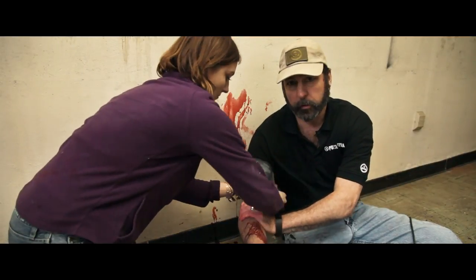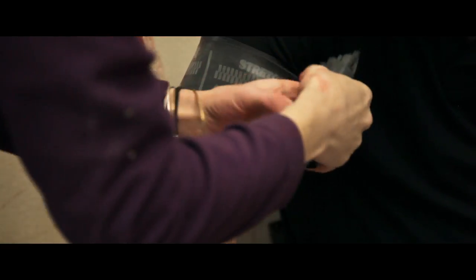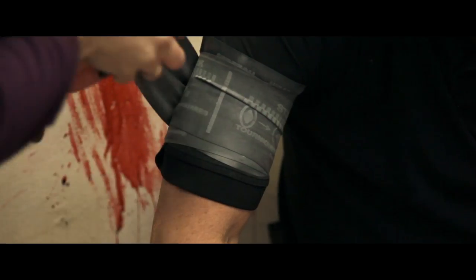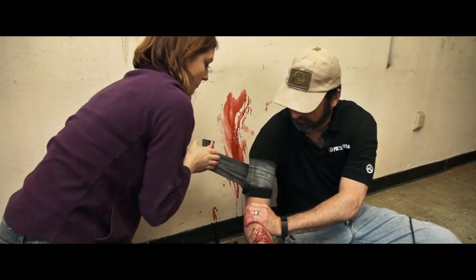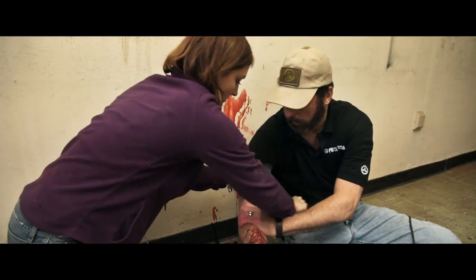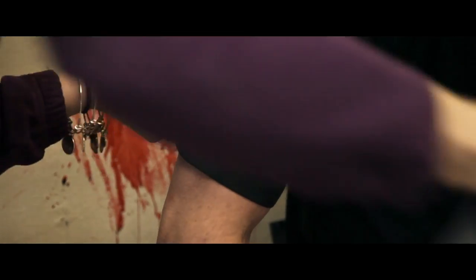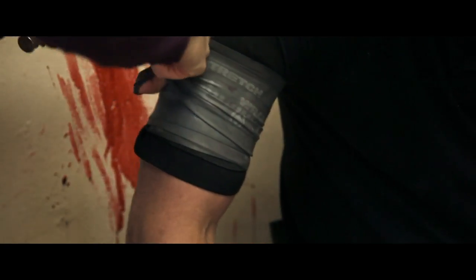When placing the tourniquet, it should be placed high up on the extremity. Once it's up high and tight, you start to wrap the tourniquet until it's held in place, and continue to exert and stretch the tourniquet so the marks indicate that the proper tension is applied. Continue wrapping until it's tight and you reach the free end, then take the free end and tuck it underneath to hold it in place.